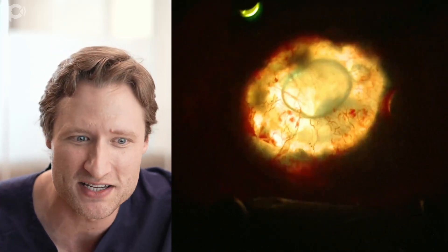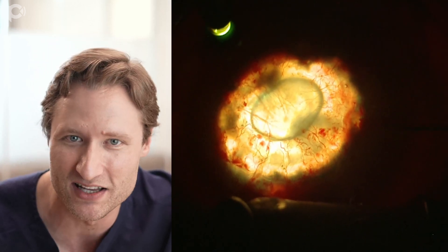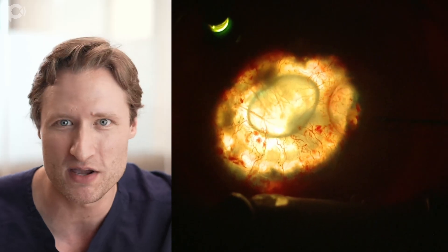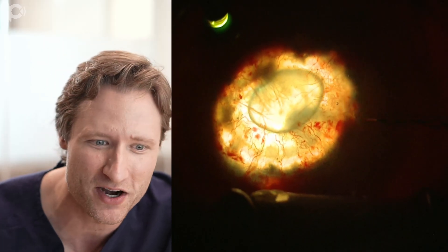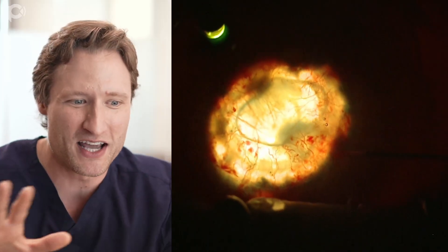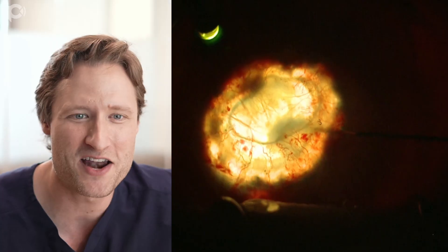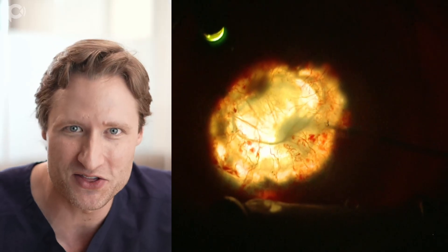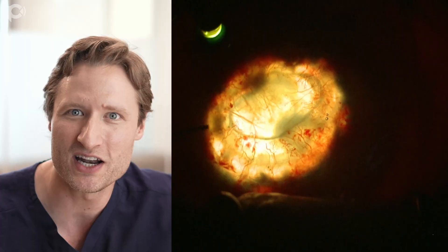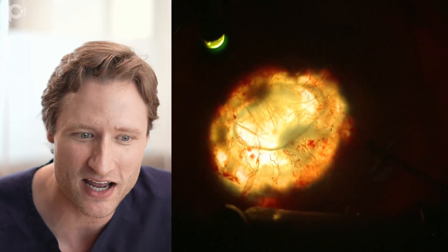You'll notice the eye kind of twitching as I'm pulling this out. That should make it a little easier because now I don't have fluid competing with me to put air in the eye. So I try to go back through a paracentesis - but look, everything shallows up. The bubble expands and the eye sort of shifts. We've still got an eye that wants to be a problem even at this late stage, and I'm thinking how I can inflate the anterior chamber without screwing up the operation.